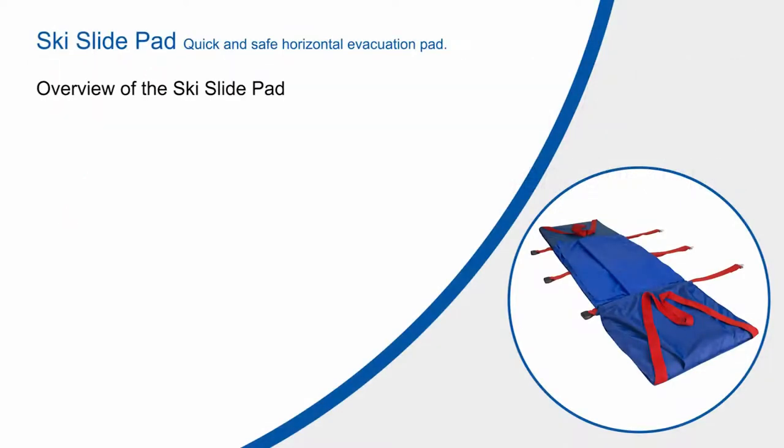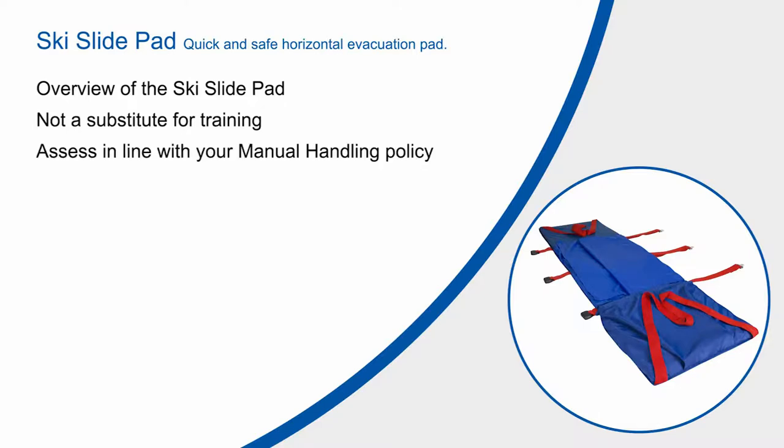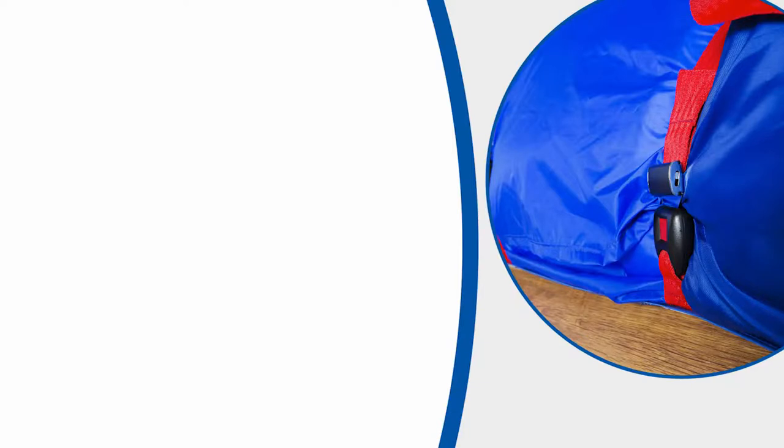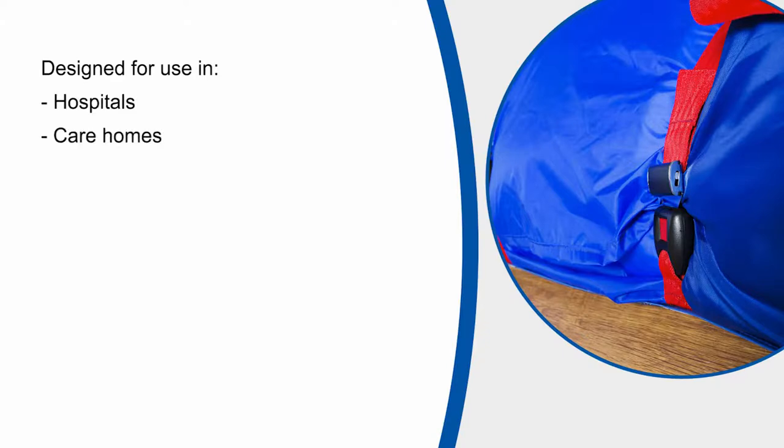This video is designed to give you an overview of the ski slide pad and is not intended to be a substitute for actual training with the product. The video needs to be assessed in line with the manual handling and cross-infection policies in place within your organisation. Please bear in mind that although the video has been filmed within an NHS hospital, the equipment has been designed for use in various types of buildings where the available space is quite often very limited.